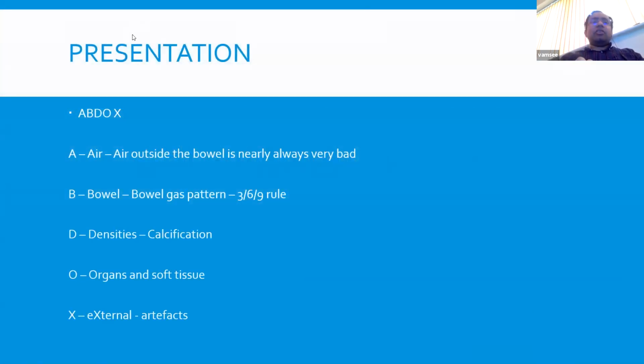Okay, so similar to chest X-rays, I've always used a pattern for abdominal X-rays, because I'm a simple person and I can remember the simple patterns.